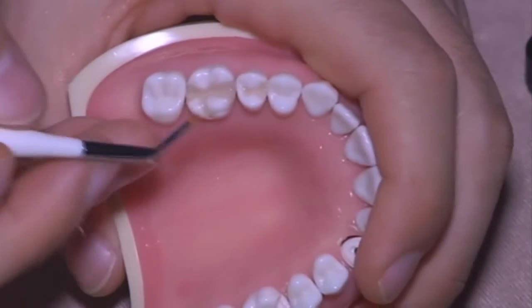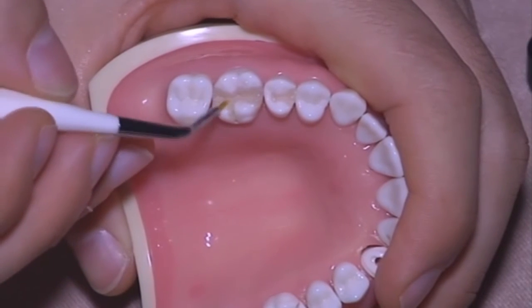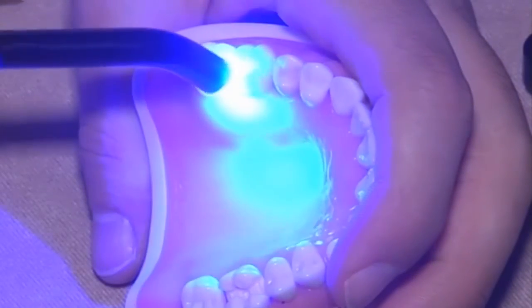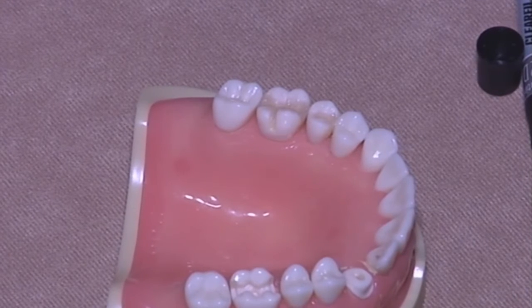Okay, just the palatal sides of the cavity.